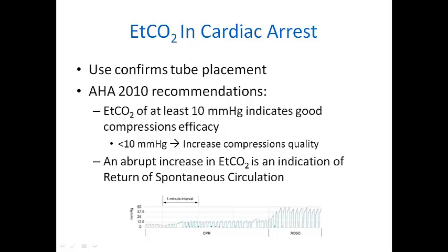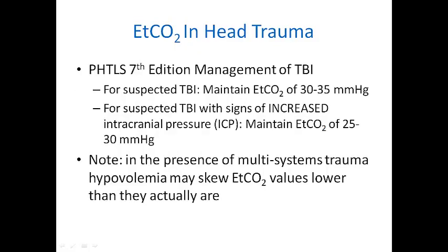Also, trending over time, which is present in the waveform at the bottom of the screen, can show that the return of spontaneous circulation has occurred well before pulses are present in our patients. An abrupt increase in end-tidal CO2 during resuscitation is an indication of return of spontaneous circulation. End-tidal CO2 is also useful in the management and monitoring of head trauma.